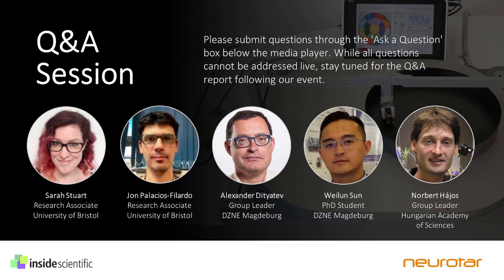We found that the average time for a juxta recording is about 10-15 minutes. This depends on many factors like the size and the quality of the craniotomy and the tip of the glass pipette. We have recorded on some occasions neuron spiking for more than 20 minutes while the mouse was grooming, running, and receiving several air puffs. So if everything goes well, significant data can be collected during various behaviors.